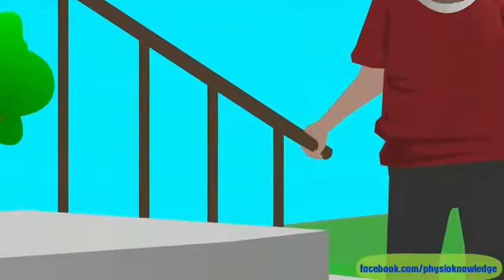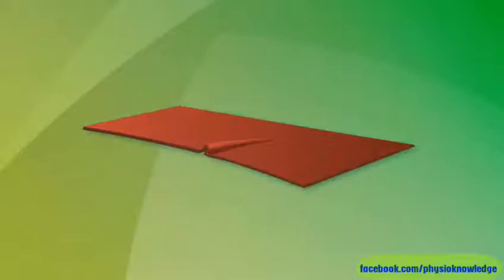If you're using stairs that have a sturdy banister or rail, hold the banister with one hand and use your cane in the other hand. Remember, when you walk, always look straight ahead and not down at your feet. And be on the lookout for things that could make you trip or fall — things like pets, kids, rugs, or cords.